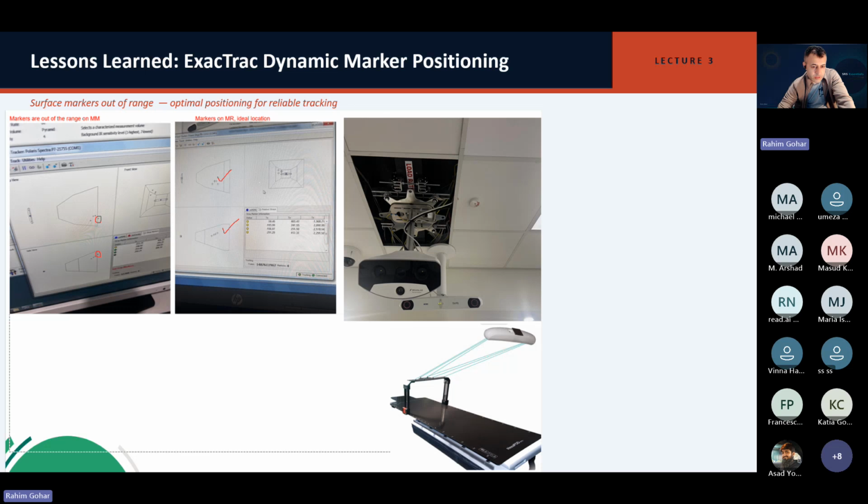So to install this eye guide camera, because of the steel, it was not easy. During the installation, the team thought it would be easy to install it off axis, which is fine because once you put it off axis, you need to give a little bit of tilt, the angulation, so that you can cover the whole angle. If it is center, you don't need to give any angle, but it was off axis. Therefore, the executive guys came and said, okay, we have to put it here, so we have to do this welding again, and this was put.